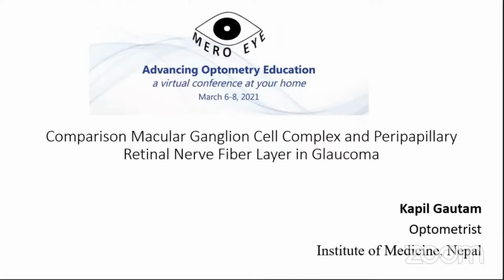So this is the study that shows that if we can't directly measure the peripapillary retinal nerve fiber layer, then we can go to the ganglion cell complex, right? This is very clear: this is the area of the macula, and the ganglion cells. I will go briefly through the introduction and everything about the ganglion cells.